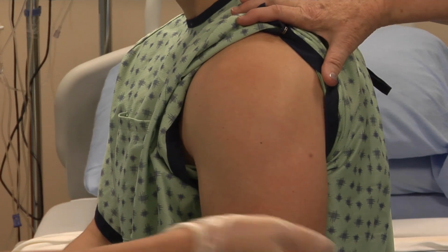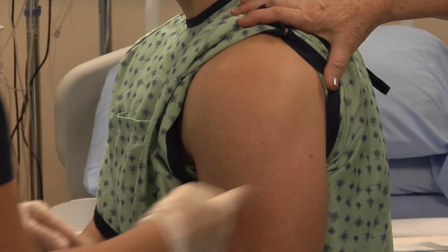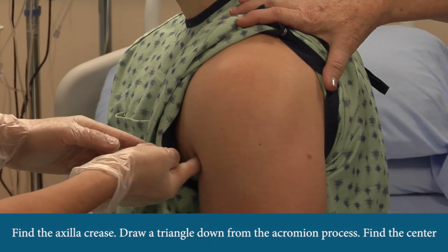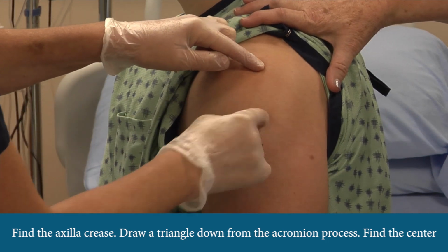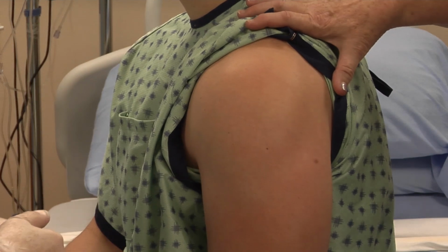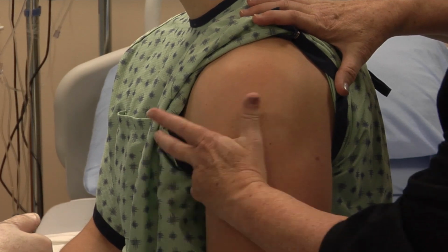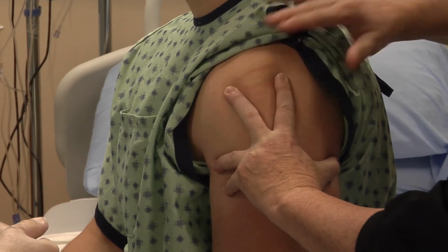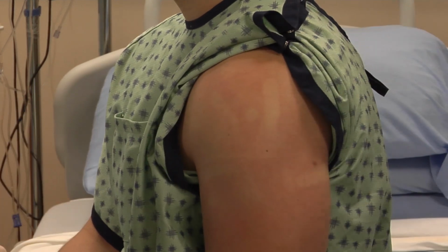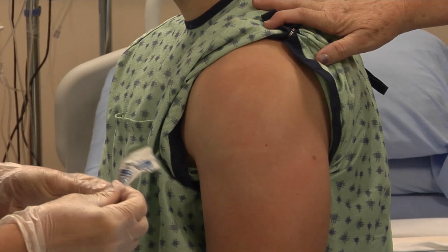Another way to landmark is to find the axilla crease, draw a line, and then draw a triangle from that acromion process. And again, you're right in the center. And you have a third way. Oh yeah, you just sort of run your finger up into the armpit, lay your hand down, and you'll have the V, and then you're just 2 down there. So right there. Same. So it all comes to the same place. We've all arrived at the same place.